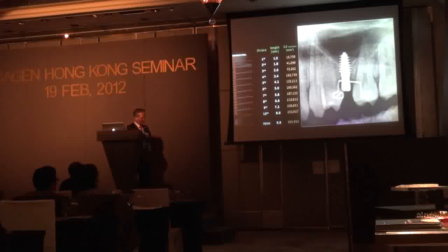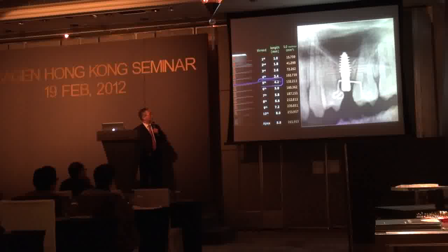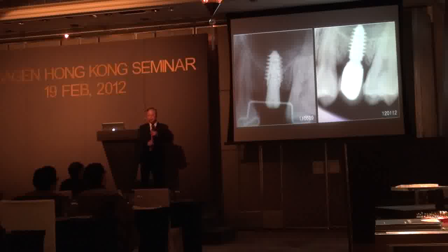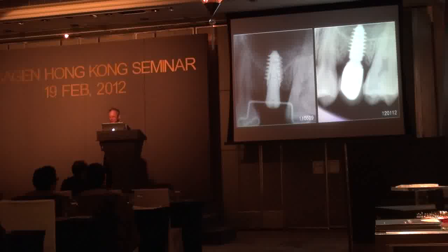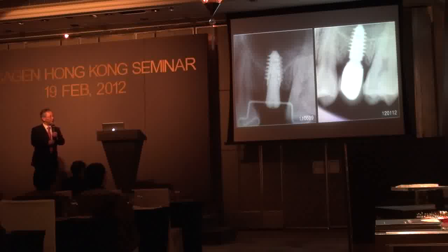See? So let's compare with the diagram. How many threads did I engage with the sound bone? So 1, 2, 3, 4. So from the top, I engaged this much implant surface to the bone. See? And then this is almost the same as this 4 by 10.